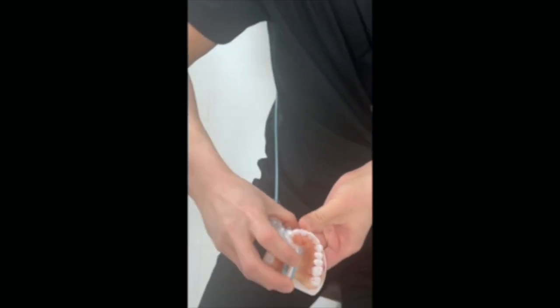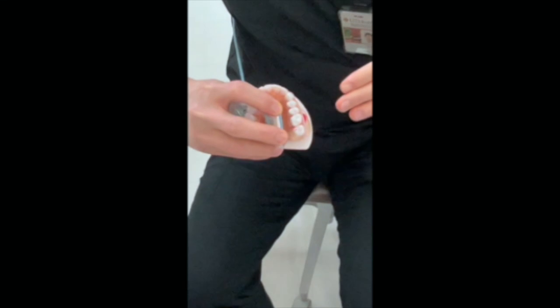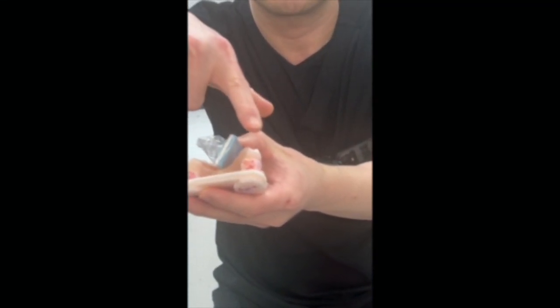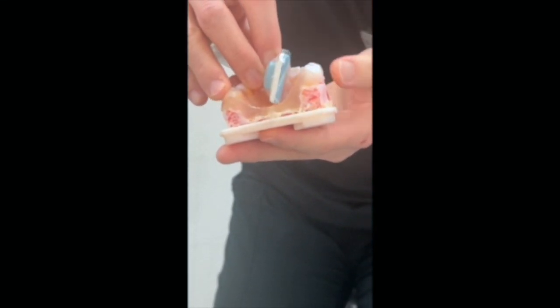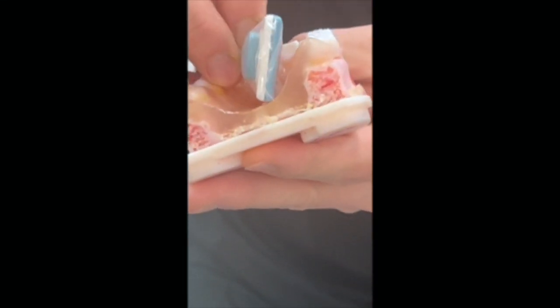Once you've got the angulation correct, you can place the X-ray tube in the center, and then you can take the radiograph. Let's say for the maxillary first molar and second molar, the palatal root is angled this way, and the mesiobuccal and distobuccal root can be angled so that they're divergent. In this case, when you take this angle, it sometimes can be difficult to see the palatal apex. So how would you take the palatal root since it's so diverted?